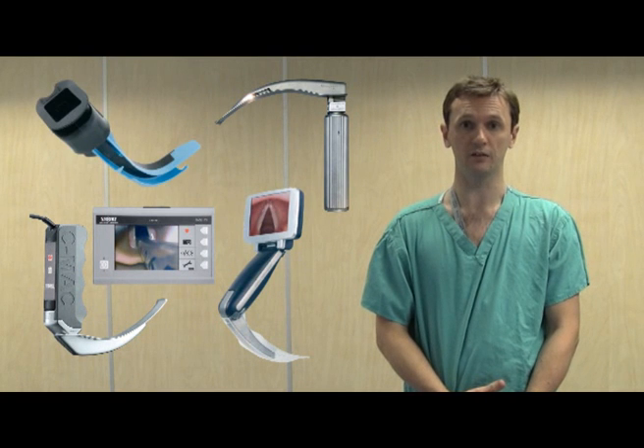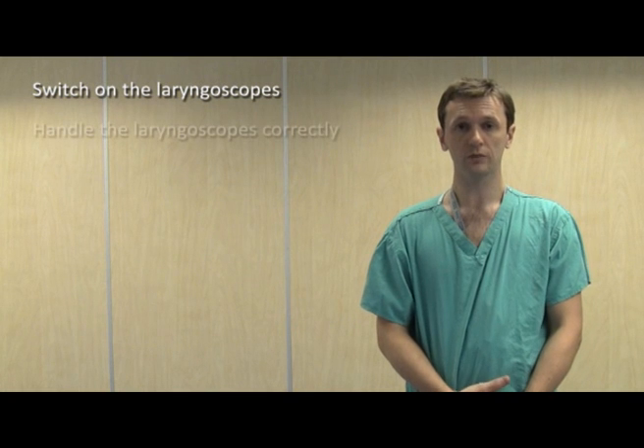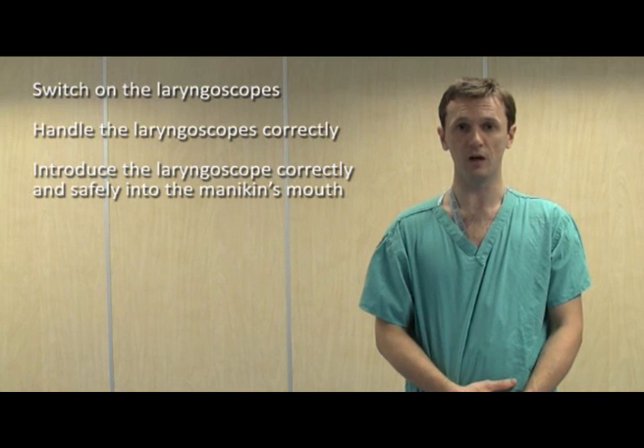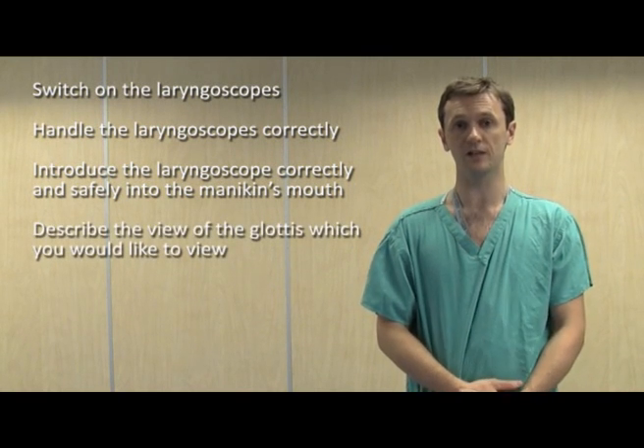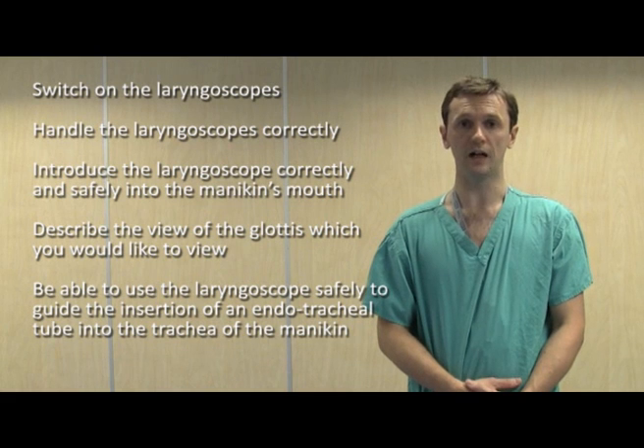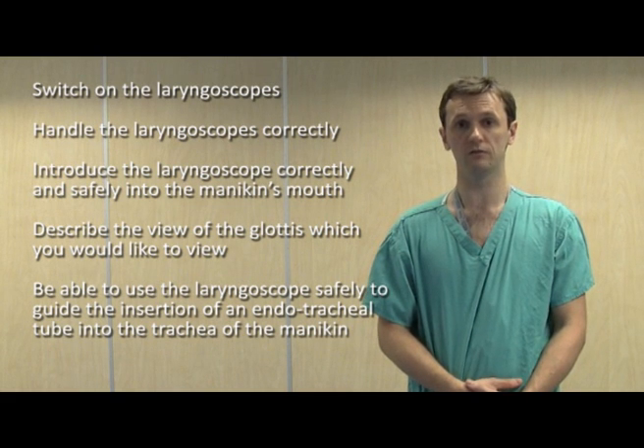So there you have it. I've demonstrated the correct and safe use of the Macintosh laryngoscope, the C-Mac laryngoscope, the AP laryngoscope, and finally the Airtrack laryngoscope. Now you should be able to switch the laryngoscopes on, handle them correctly, introduce the tip of the laryngoscope blade safely into the mannequin's mouth, describe the anatomy of the glottis, and use these laryngoscopes to guide insertion of an endotracheal tube into the trachea of the mannequin. After you have viewed this video and had a chance to review it, the study team will ask you to perform laryngoscopy on the mannequin using the devices in the video. Thank you.